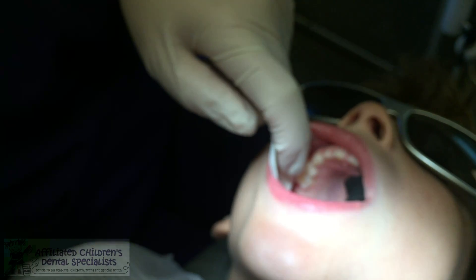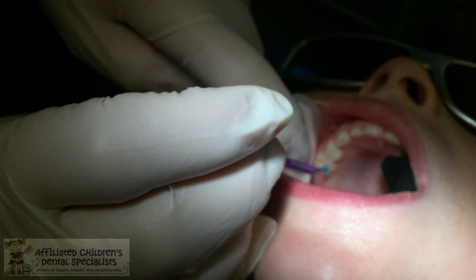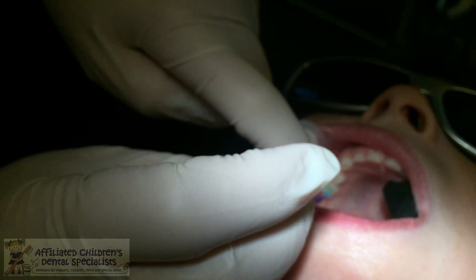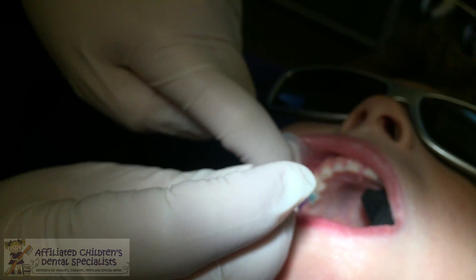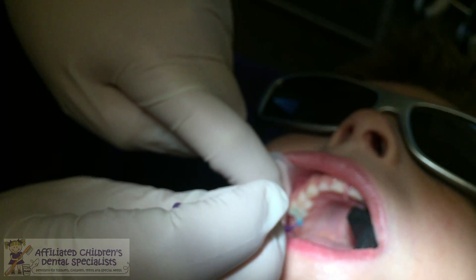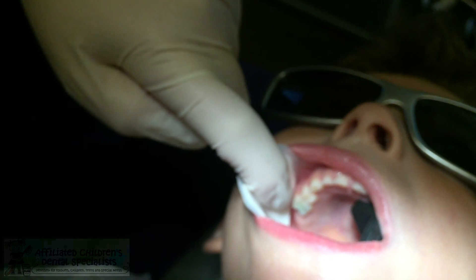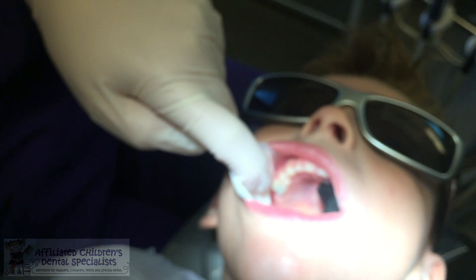The next thing I'm going to do is use a little cleaner — this is cavity conditioner, polyacrylic acid. This is going to remove the smear layer and open up the dentinal tubules so the silver diamine fluoride soaks deeper into the tooth, and it's going to allow for a better chemical bond of the glass ionomer cement. You just apply that for about 10 seconds and then rinse it off. Just keep breathing through your nose. We're going to rinse your tooth.